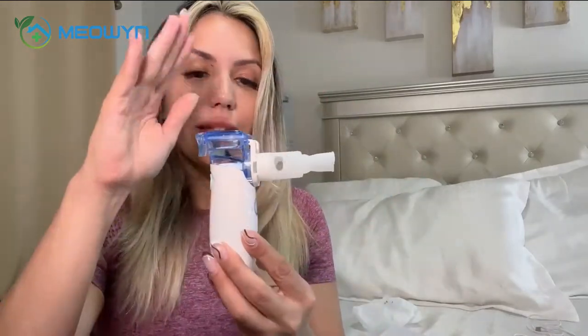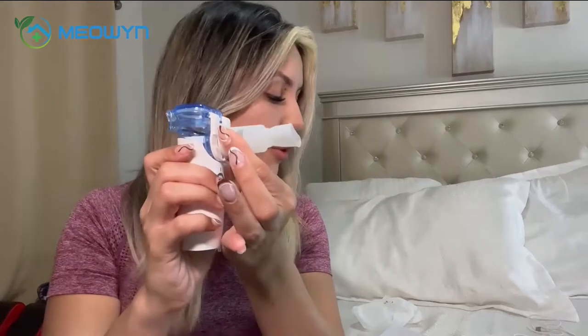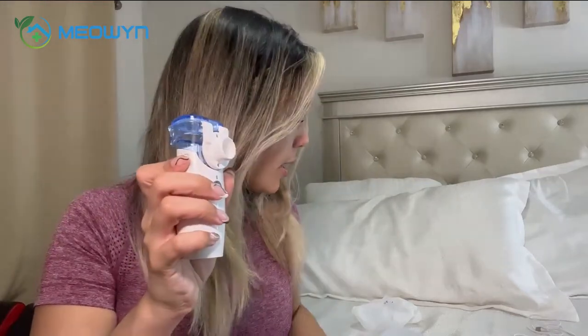The nebulizer comes with this piece, which is the actual machine. It comes with the medicine cup and three different attachments — this is one of them, the one I've put on here. Then we have the adult size cup and the child size face mask cup.